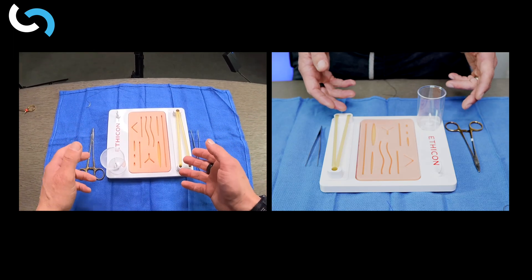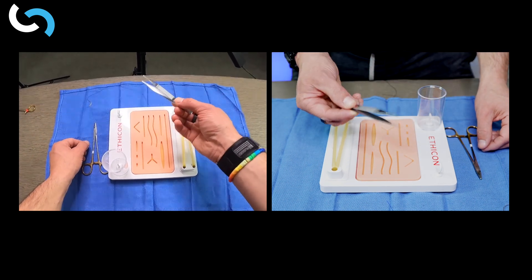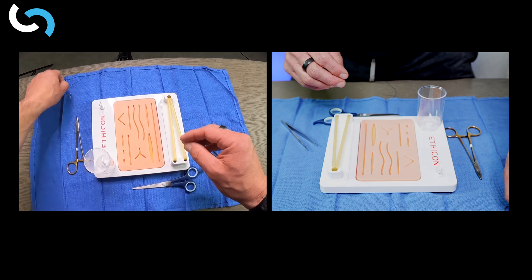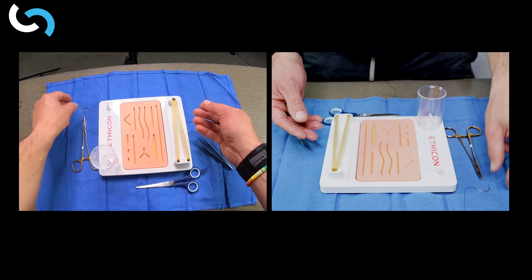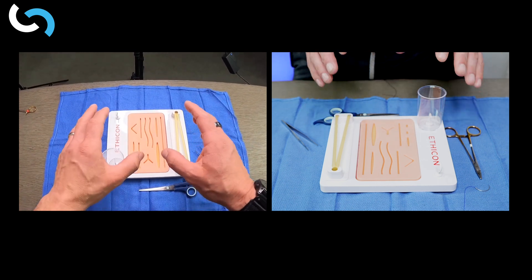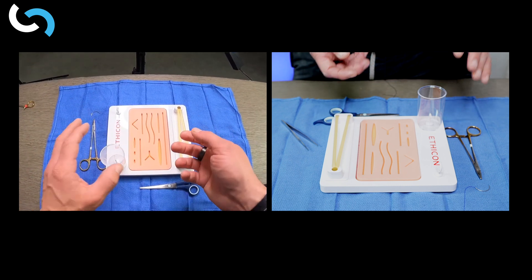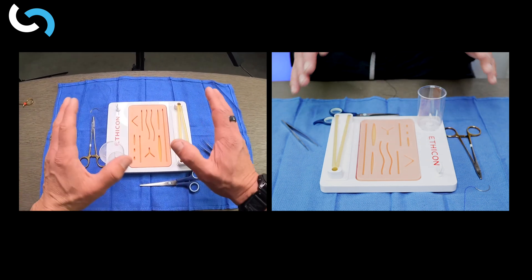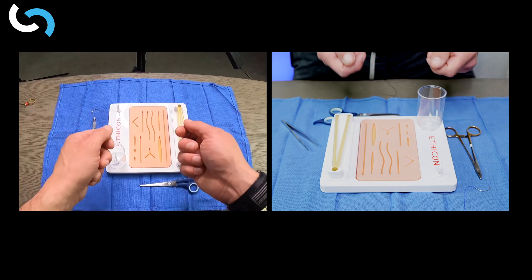When it comes to suturing, we have a few different things: our needle driver, our forceps, a pair of scissors to cut the suture, and our suture — the 2-0 PDS on a CT1 needle. Finally, we need something to practice suturing on. Ethicon gave me this fantastic suturing board, which is perfect for demonstrating and practicing suturing. It has areas for deep ties, hand ties, and suture ligatures. But you don't have to be this fancy — if you want to grab a banana or an orange, you can use whatever you have. The important thing is that you practice.